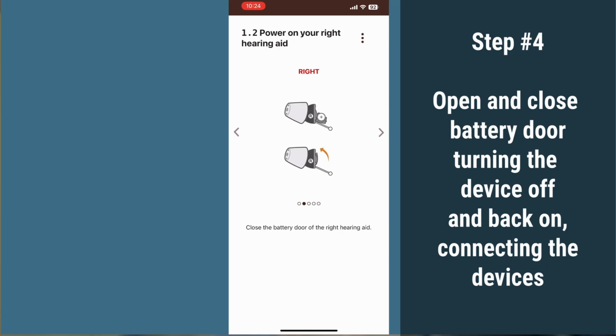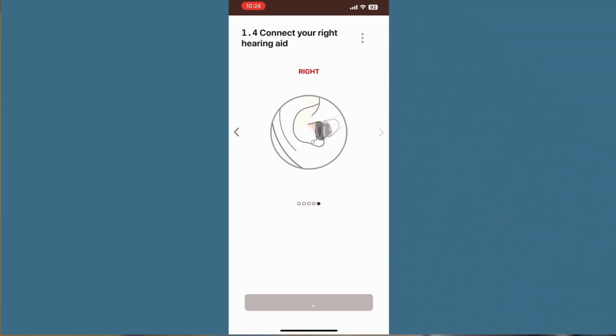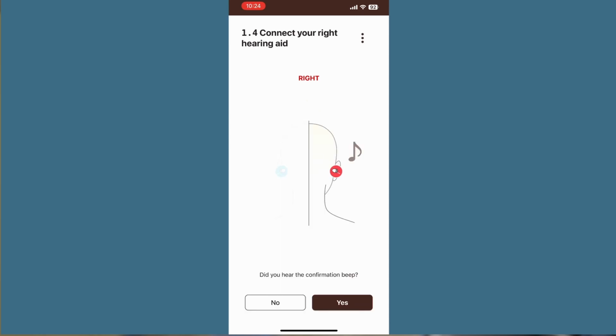Again, open and close the battery door. Put the hearing aid in your ear and listen for the tone. Okay, and now it looks like we've got the right connected as well.